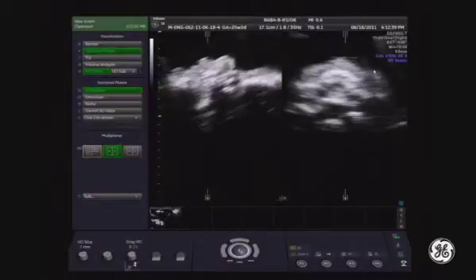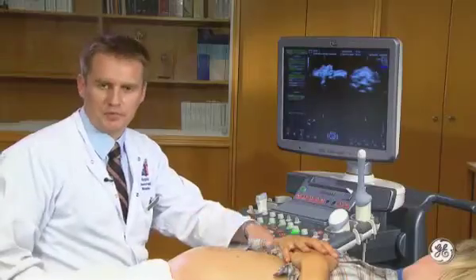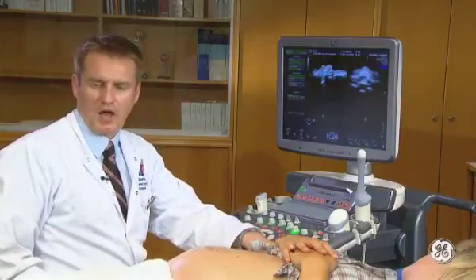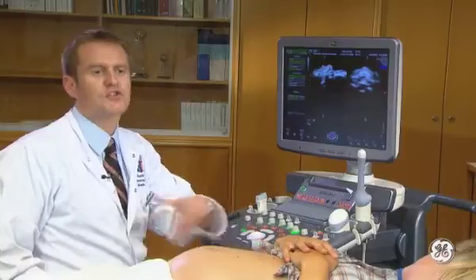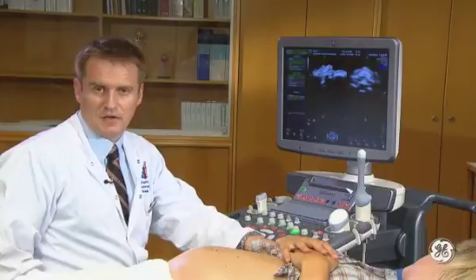You can see how important is the acquisition process and the approach for the acquisition in case of palate, because this extension guarantees the success for the 3D evaluation of the palate.